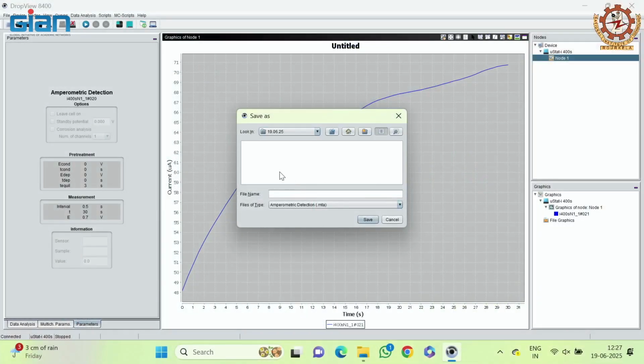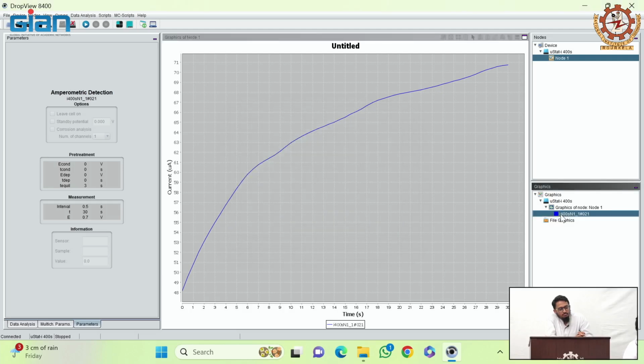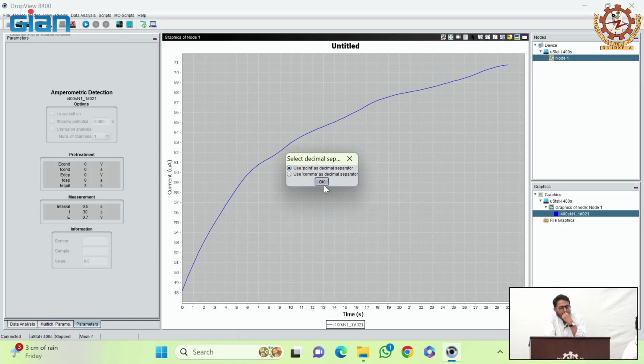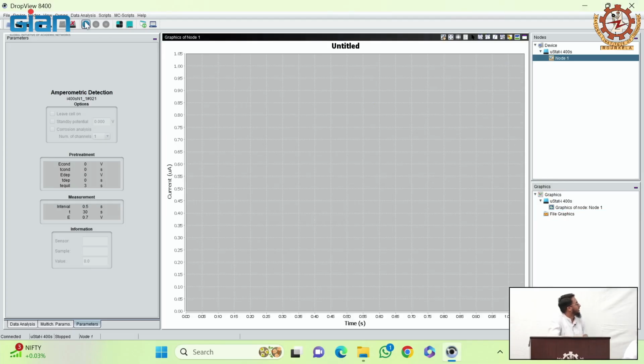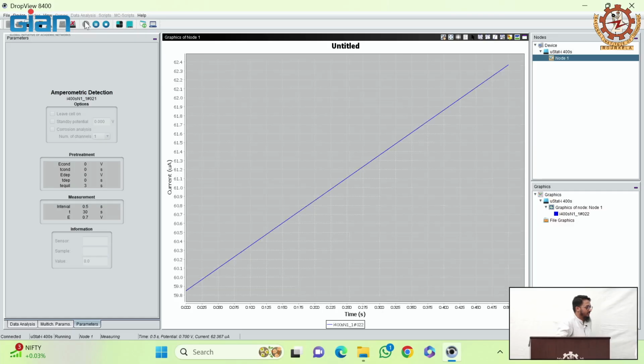You can save the files as you go. Ready? Screen. Okay, now we are ready to start the third one, which is 5 millimolars, and then the last one, which is 7.5 millimolars.